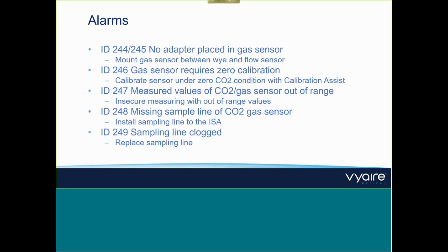Questions? Yes, Christian, thanks very much. I would like to take this opportunity to ask a question that's coming from Khalid. What about transcutaneous PCO2 compared with mainstream and side stream? What's the advantage and the disadvantage?